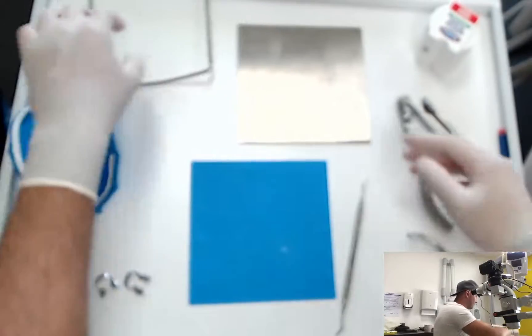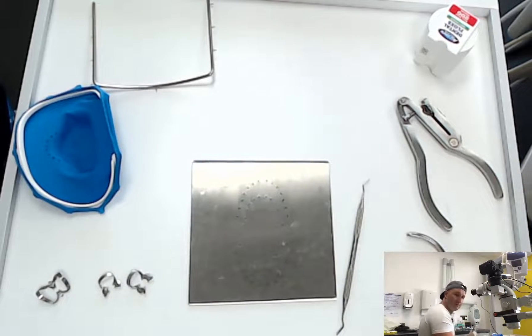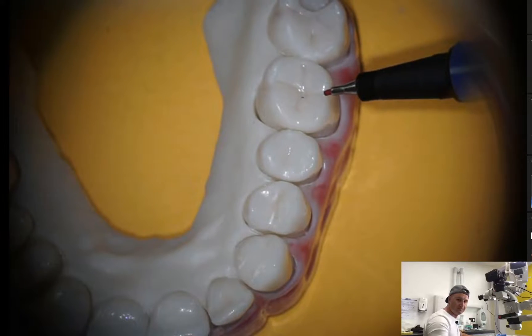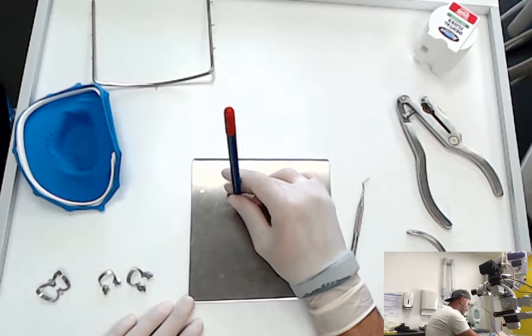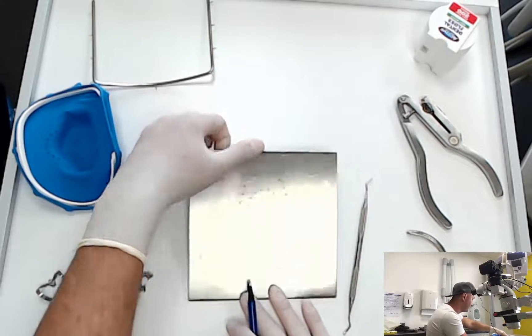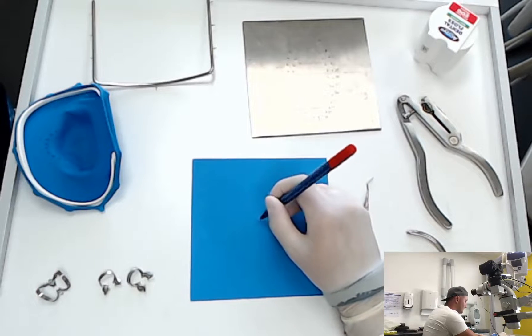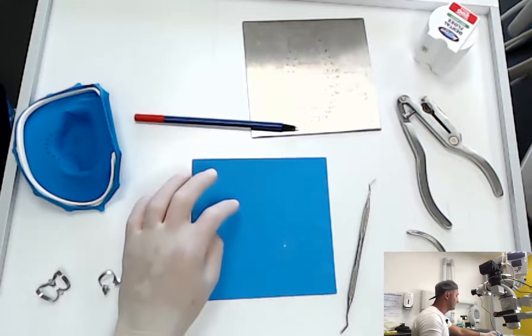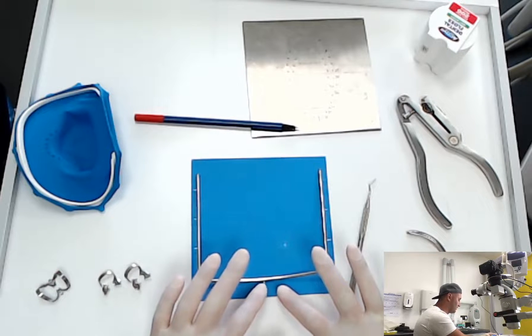After we choose the hole size, we take our template and put it on our rubber, and with a pencil we select the tooth position. In this case we're going to treat tooth number sixteen, so we choose the right position from the template. Here you have positions for primary teeth, and here for permanent teeth. For endodontic treatment it's not as critical — you can also make your mark in the middle of the rubber dam and that will be fine.